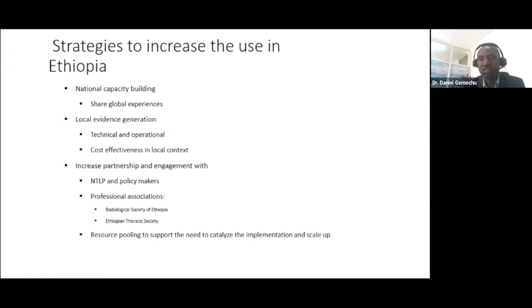One, because the disease epidemiology requires it, that patients should not be missed. Two, it's very simple. It fills the gap of the deficient human resource capacity in country, so that it can assist them to easily read the radiologic findings and also interpret and make conclusive conclusions about the disease. And third, it facilitates and assists the patient to easily access it whenever it's mounted, like whenever it is mobile, and it can be reachable where it is highly required and highly needed.